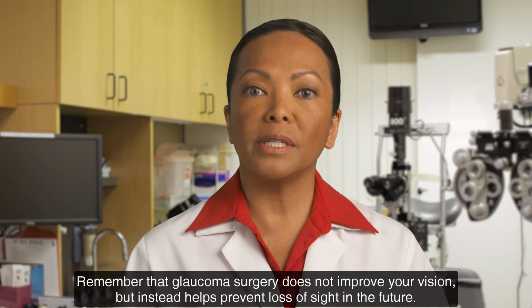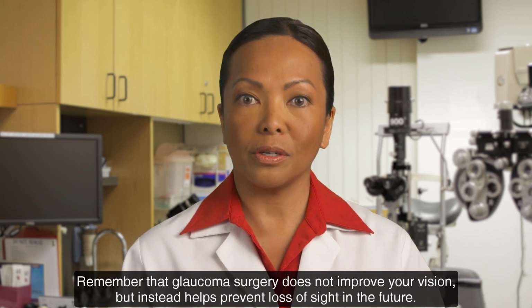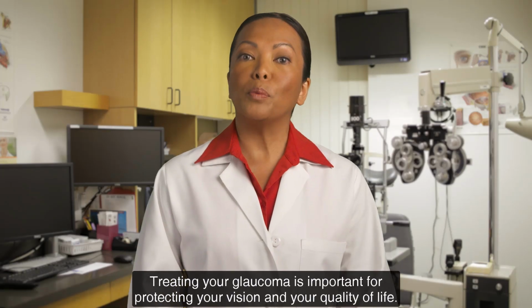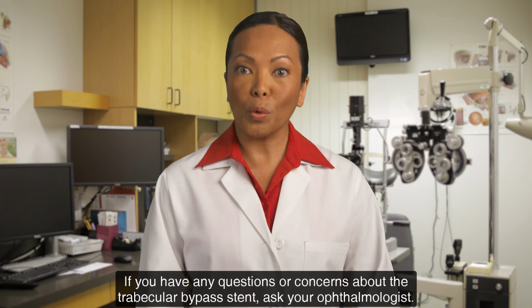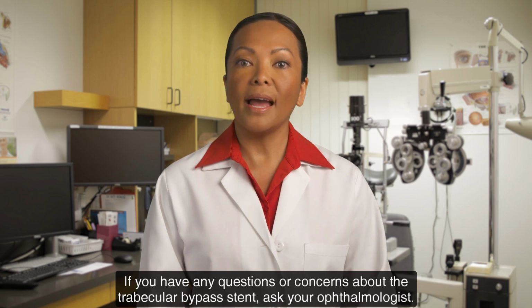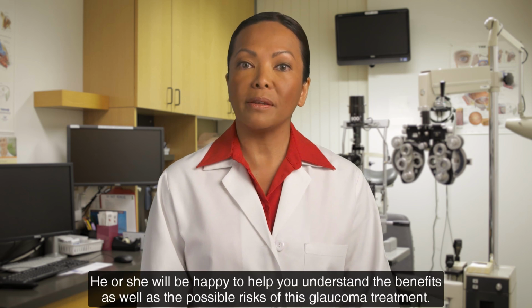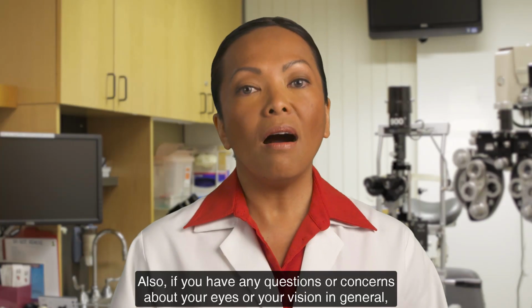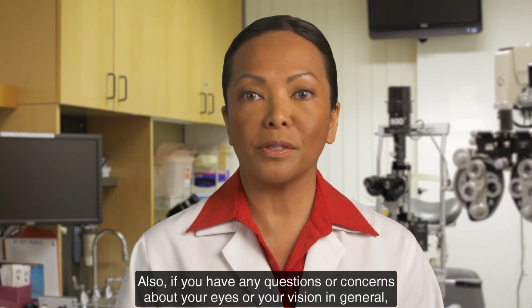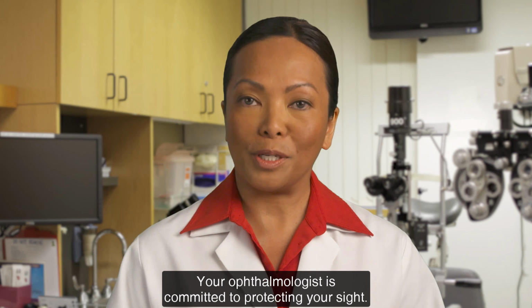Remember that glaucoma surgery does not improve your vision, but instead helps prevent loss of sight in the future. Treating your glaucoma is important for protecting your vision and your quality of life. If you have any questions or concerns about the trabecular bypass stent, ask your ophthalmologist. He or she will be happy to help you understand the benefits as well as the possible risks of this glaucoma treatment. Also, if you have any questions or concerns about your eyes or your vision in general, don't hesitate to bring them up. Your ophthalmologist is committed to protecting your sight.